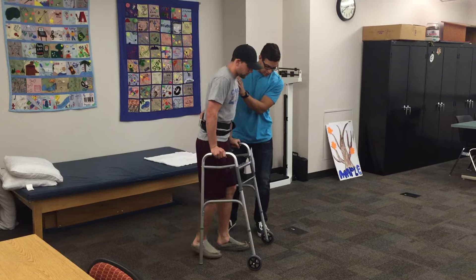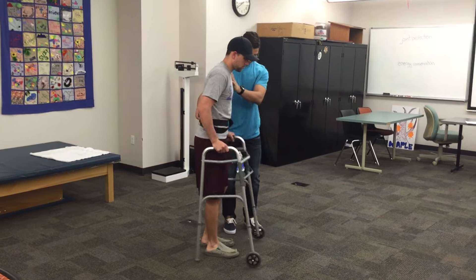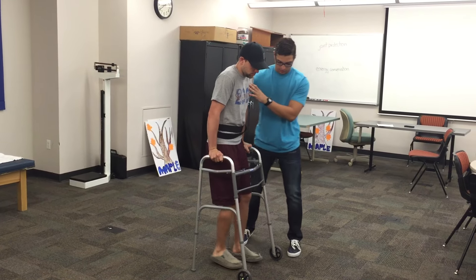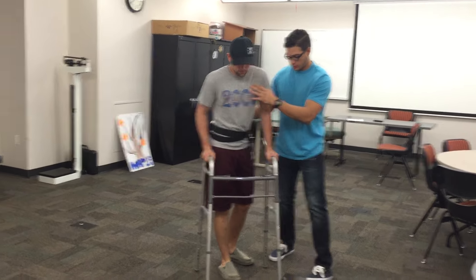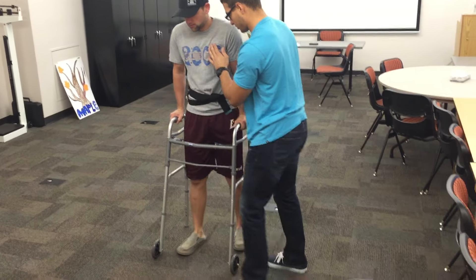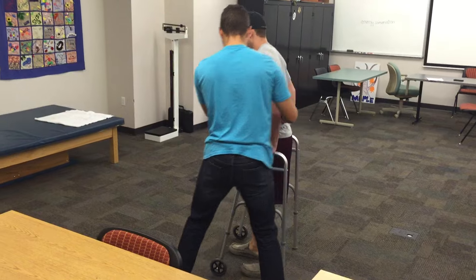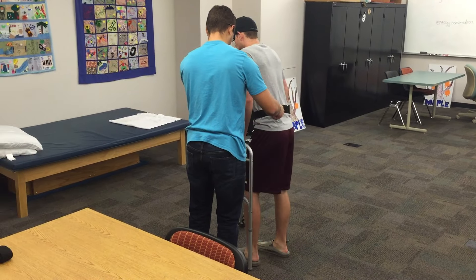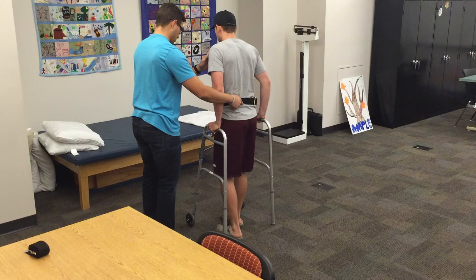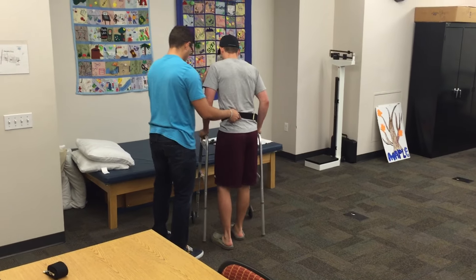Come on, nice and slow. Good. All right, we're going to go to the right. There we go — remember those small little steps. Perfect. Now we're going to start turning towards the right there. Those small steps, remember? That toe open.